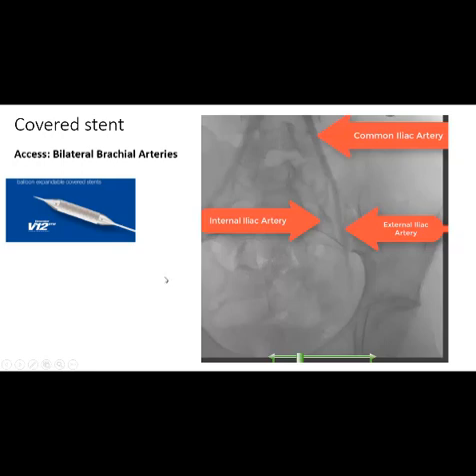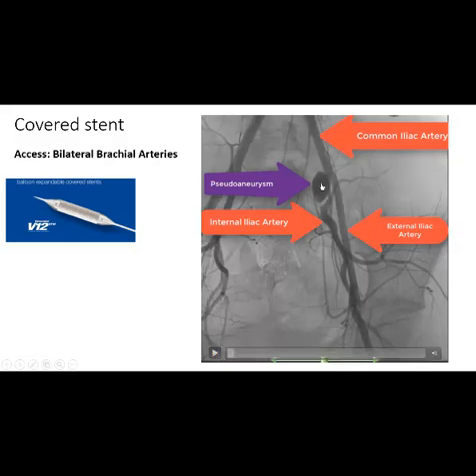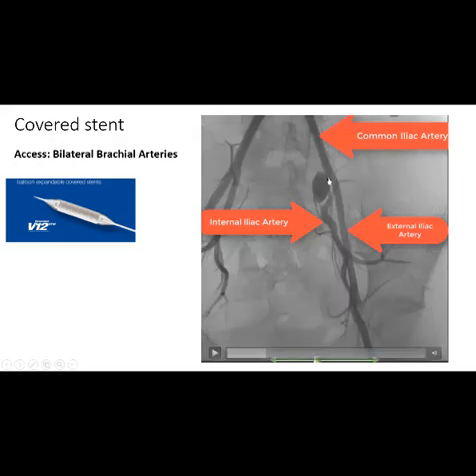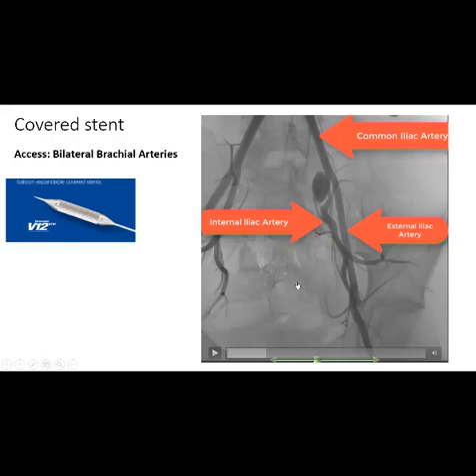Because the surgeon couldn't repair the aneurysm, we decided to go endovascular with a covered stent. You can see in the video the common iliac artery, the pseudoaneurysm or mycotic aneurysm at the beginning of the internal iliac artery, the external iliac artery, and the patent graft at the groin. Our approach was bilateral brachial artery. We were not sure about the neck fit for a covered stent, so we planned for kissing stents from the common iliac artery to both the external iliac and internal iliac arteries. But at angiography, we realized we could place the stent only at the internal iliac artery.